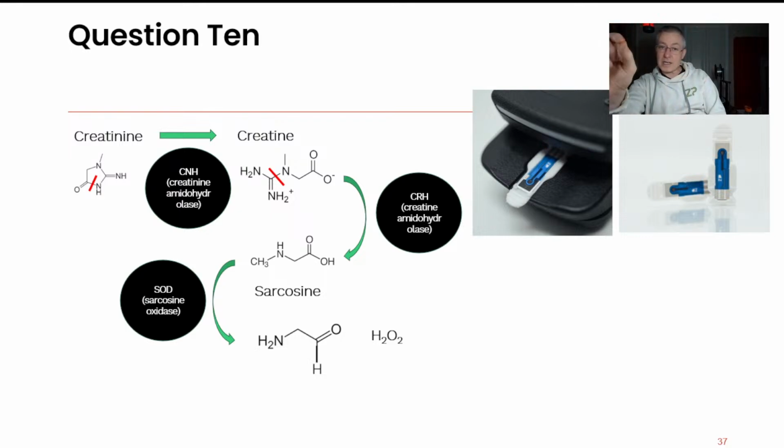Now, if you're making a product, let's say, and you're really making it for detecting creatinine in blood or urine or somewhere else, then you will need that enzyme reaction because you want to get the specificity out of it. So there, now I'm just showing you the next level of complexity. It's harder for a student group with limited resources to do this, but it is possible.